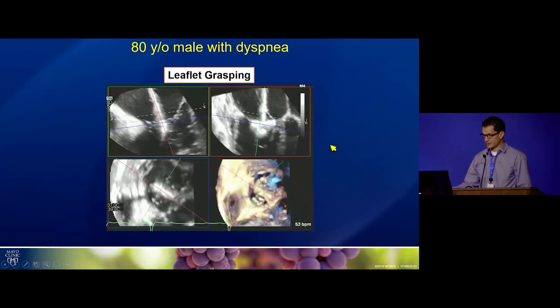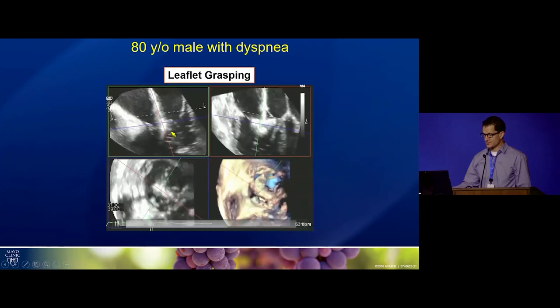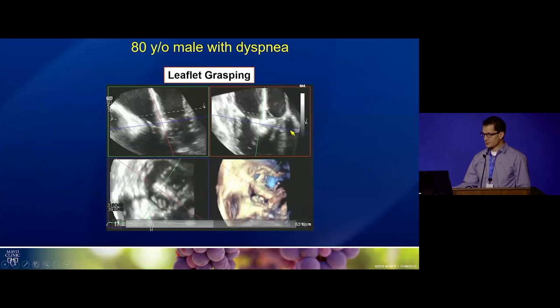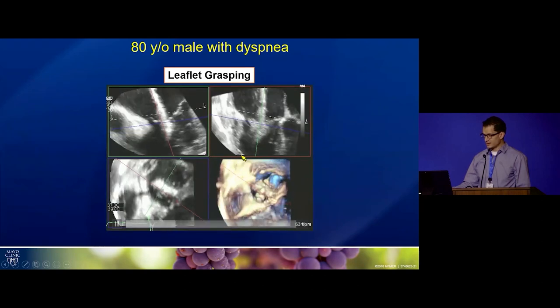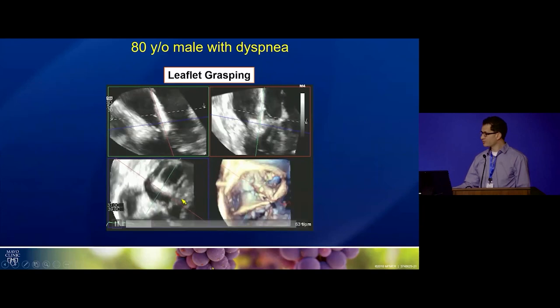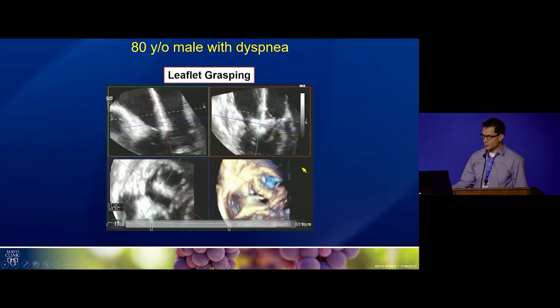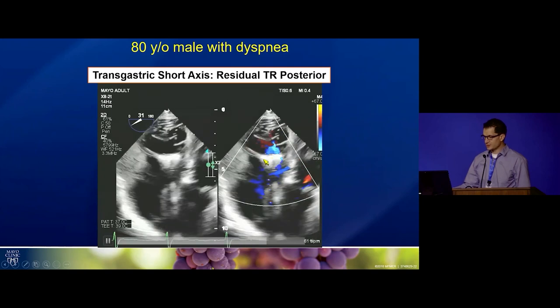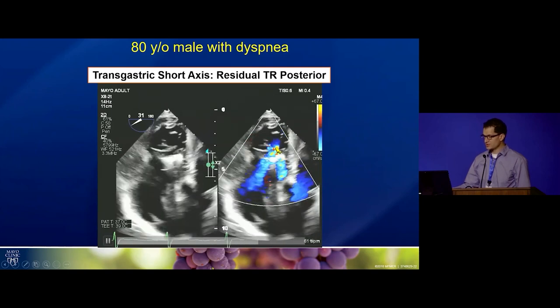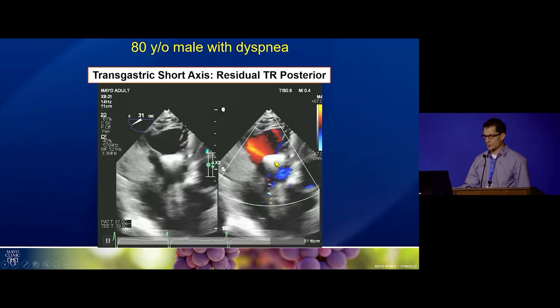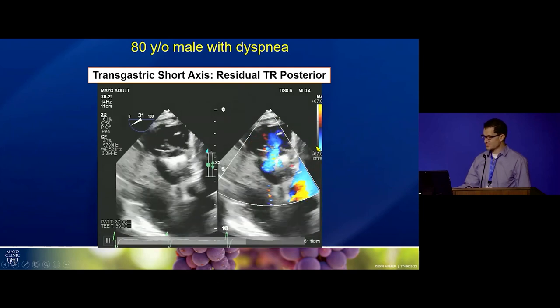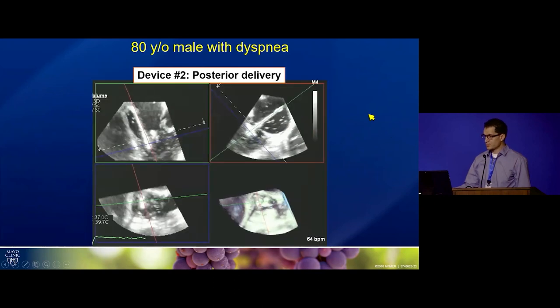During grasping, after crossing the leaflets with the device just into the right ventricle, we can see in the septal-lateral dimension that we've grasped the septal leaflet and the lateral leaflet — confirmed as the anterior leaflet by the short axis view. Looking at the transgastric view, residual TR was pinned posterior to the device, which is typically what we want. We were happy with the grasp.